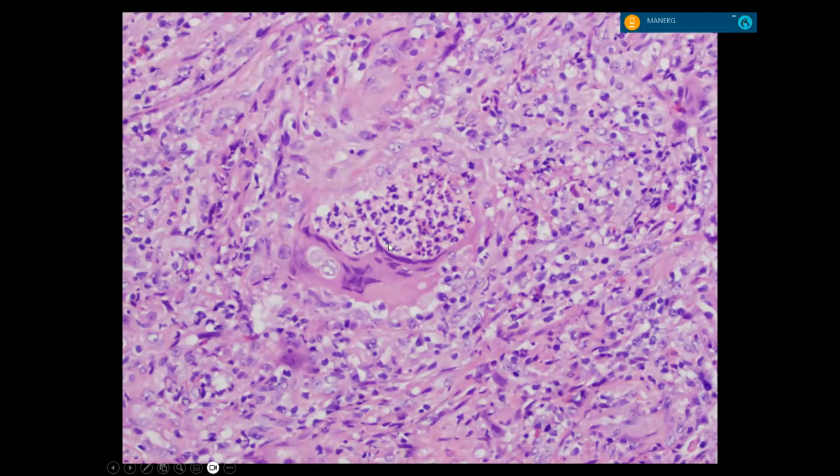No, what are these? Neutrophils. You're correct. Neutrophils have 3 to 5 lobes, and an eosinophil has 2 lobes. I see circles within a circle. Yes, to the left of the multinucleated giant cell. So cocci. You're close.